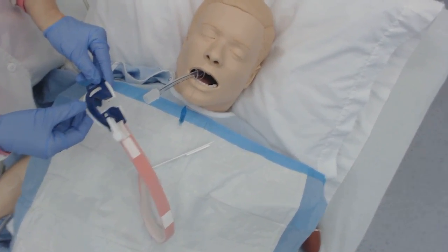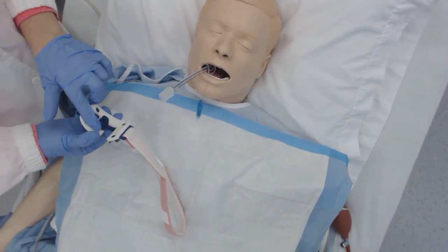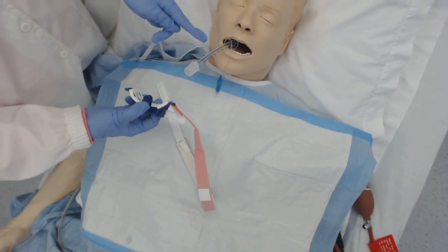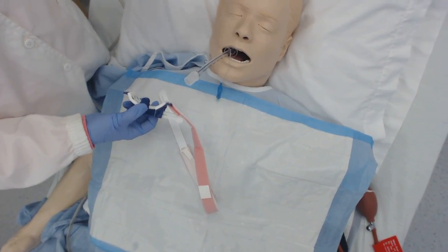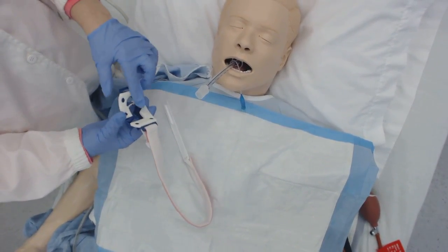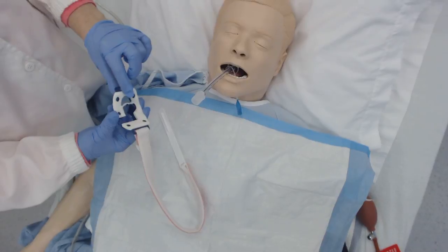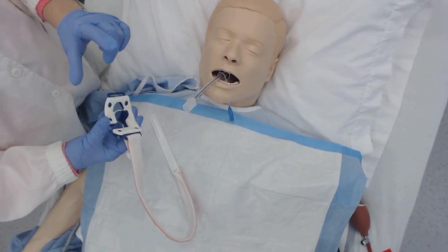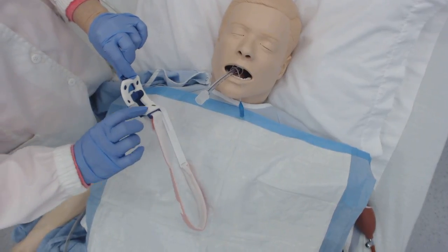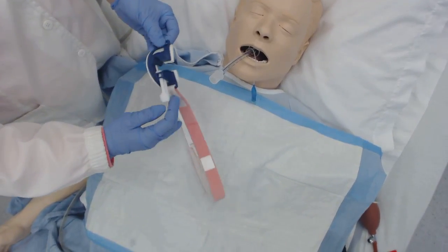What's nice about this is that it has a bite block, so the patient is not going to be able to chew this. A long time ago, if a patient had their own teeth and had an endotracheal tube, they could actually chew through part of it. This bite block helps prevent that, and it also makes it easier to perform oral care. It's nicely cushioned on the back.